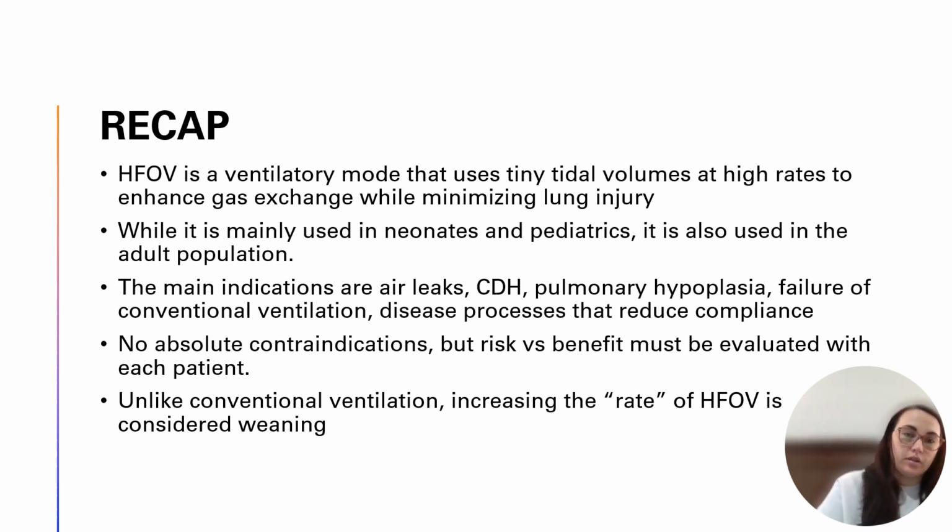Are there risks of putting them on the oscillator outweighing the benefits? Are we going to tank their blood pressure? Are they going to need too much sedation? Do we need them to be mobile to reduce swelling? Things of that nature. And then, unlike conventional ventilation, increasing the rate is considered weaning. That's a really important thing to remember.